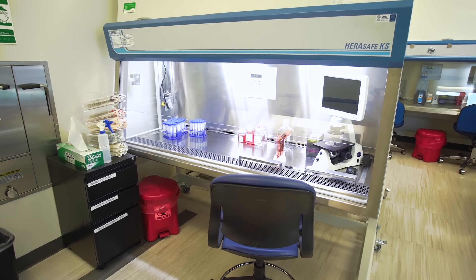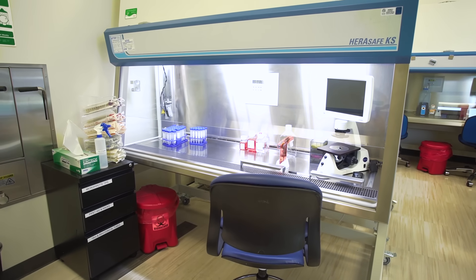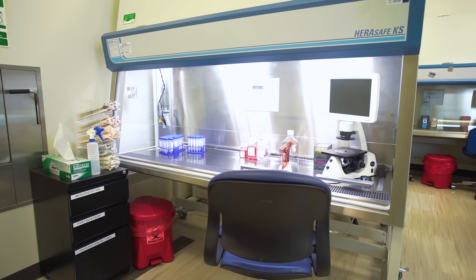Successful cell culture depends upon many factors, including the quality of the cells and reagents you use, your sterile technique, the amount of experience you have, and the right laboratory equipment.